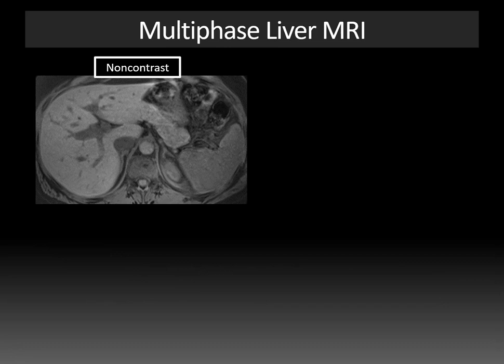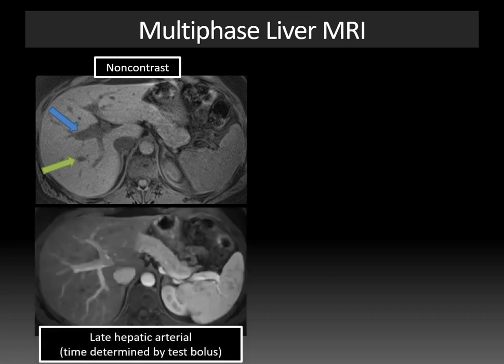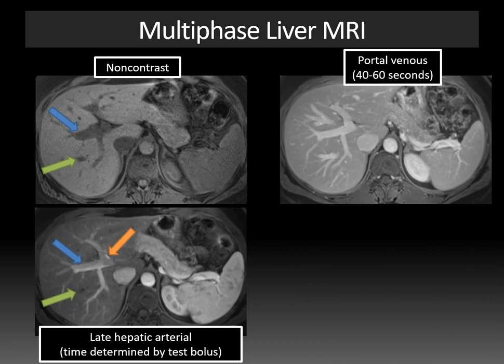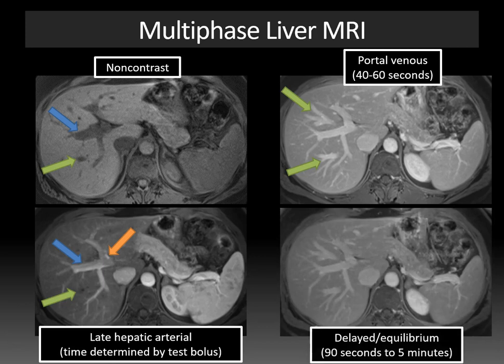Here's a typical T1 3D gradient echo fat-suppressed image without contrast — the portal vein and hepatic vein are hypointense and non-enhancing, and the subcutaneous fat is dark because it's being suppressed. When contrast is given, the late hepatic arterial phase shows the hepatic artery enhancing with the orange arrow and the portal vein with the blue arrow, but the hepatic veins are not yet enhancing. The subsequent portal venous phase shows the hepatic veins diffusely enhancing, with much brighter parenchyma. Then the delayed or equilibrium phases begin, and everything gradually diminishes in signal as contrast leaks out.